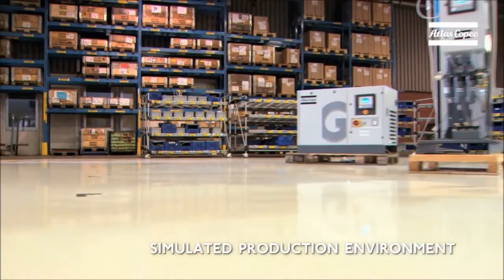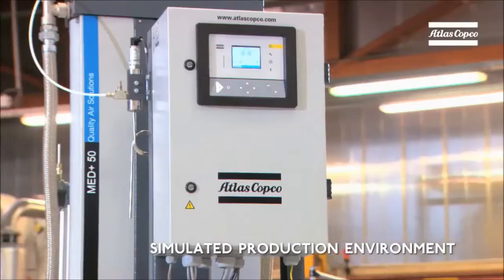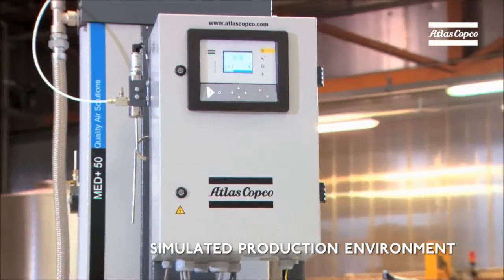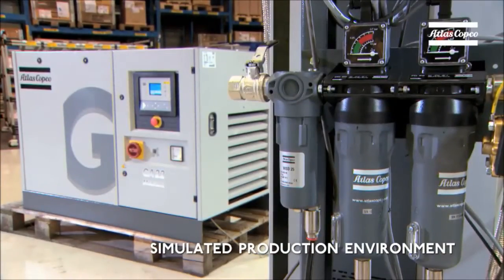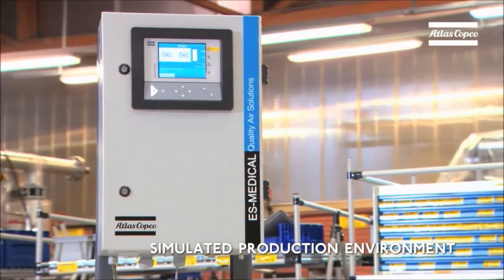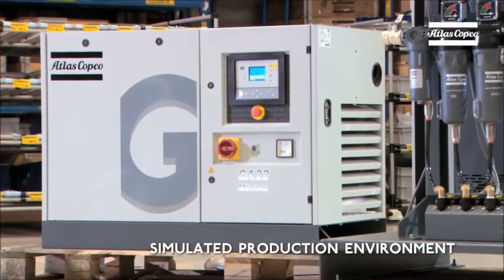Let's go over all the hard work and the inspired ideas that went into the new medical air plant. To give you a clear idea of this great piece of engineering, we've simulated a production environment. Remember, when you're on a real production line, make sure to wear safety shoes and a reflective vest.